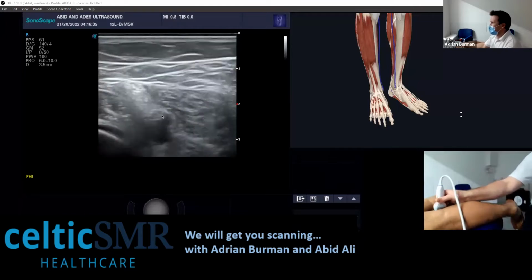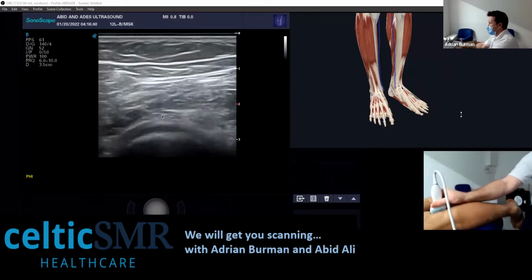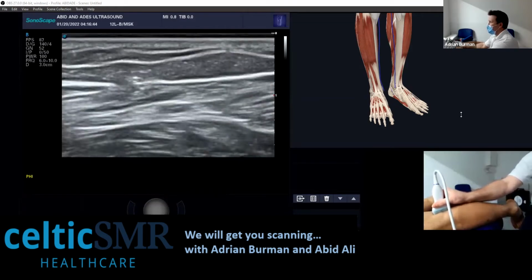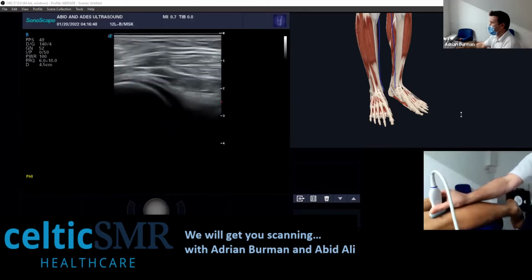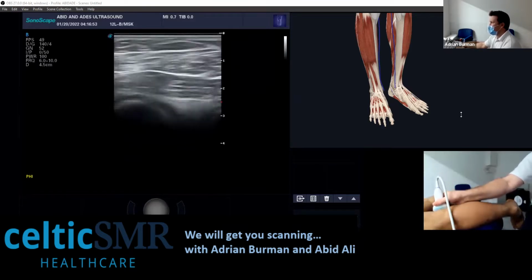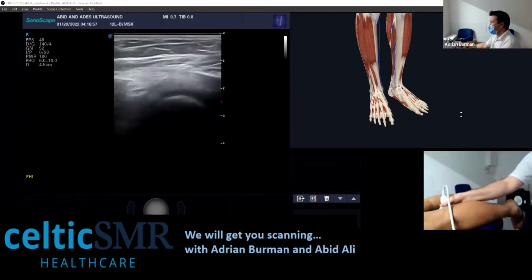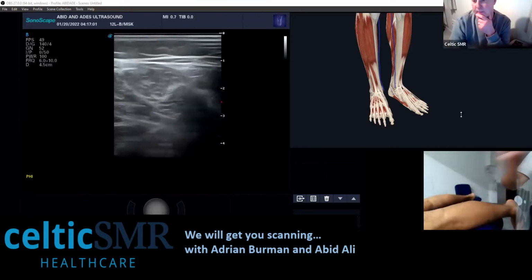not too much to see. I mean, you can see obviously effusions and foreign bodies, calcification, cortical irregularity in the joint, some nice cartilage there. Again, as I say, tendinopathies and things like that. Okay, thank you.